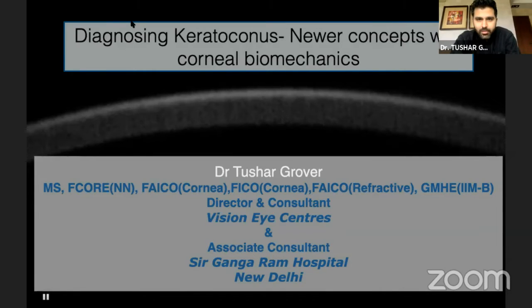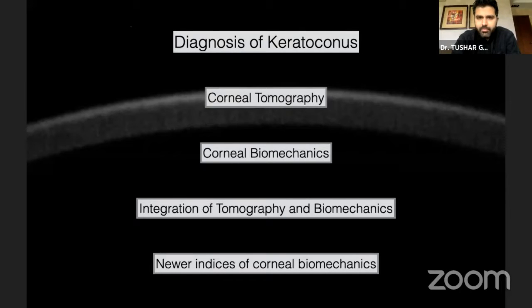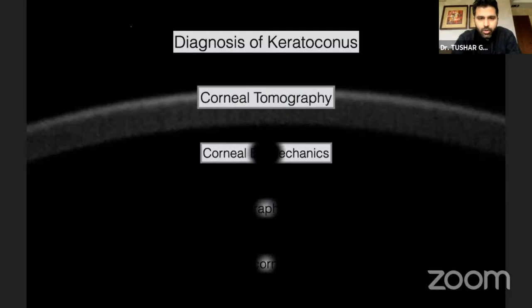I'll be talking about diagnosing keratoconus, and I'll start with a little bit of tomography because we intend to speak to the general ophthalmologist, but we'll focus primarily on biomechanics, and that's how the presentation would go.